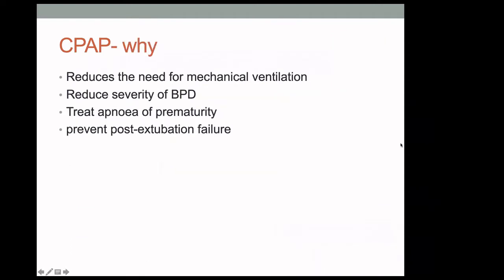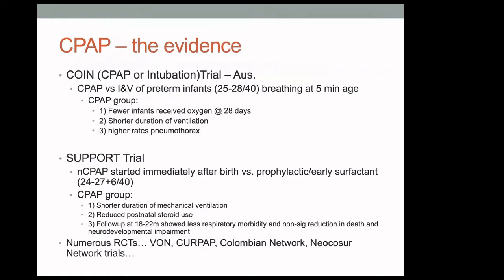And the reason why we use CPAP is basically as a non-invasive method of reducing the need for mechanical ventilation. CPAP has also been shown to reduce the severity of chronic lung disease or BPD, and it can also be used to treat apnea of prematurity, and it can be a non-invasive ventilatory method to extubate on from a ventilator.